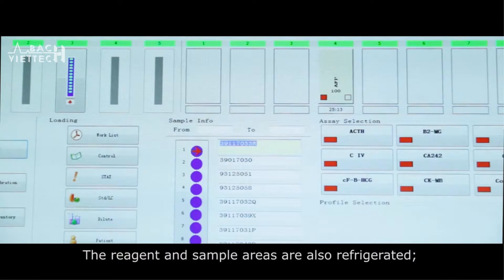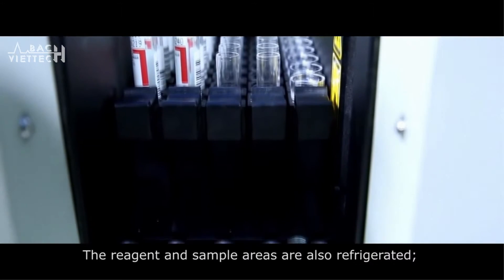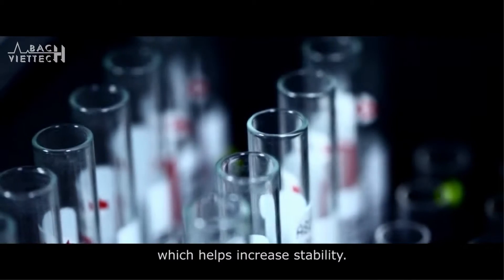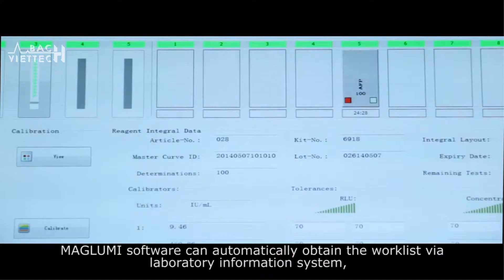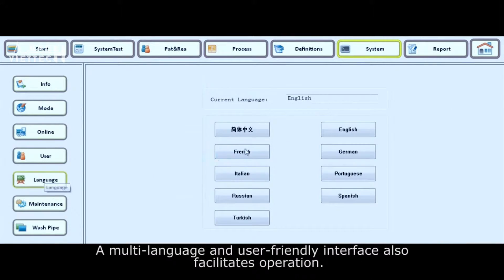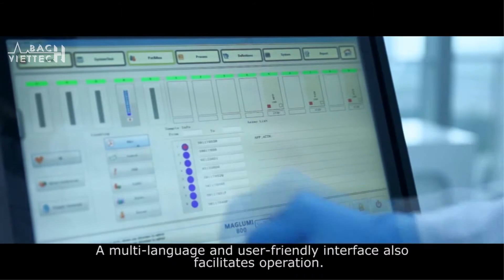The reagent and sample areas are also refrigerated, which helps increase stability. The Maglooby software can automatically obtain the work list via a laboratory information system or via manual input by the operator. A multi-language and user-friendly interface also facilitates operation.